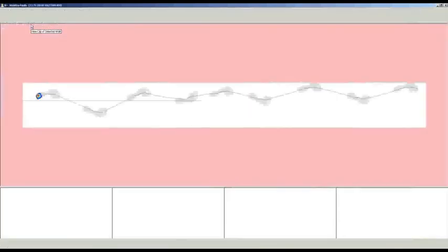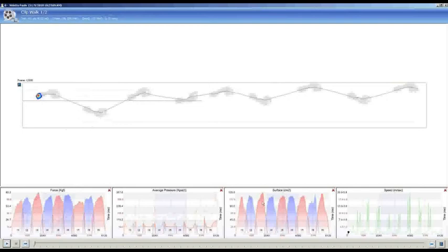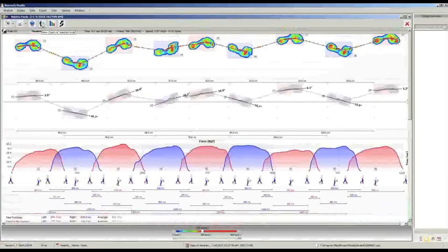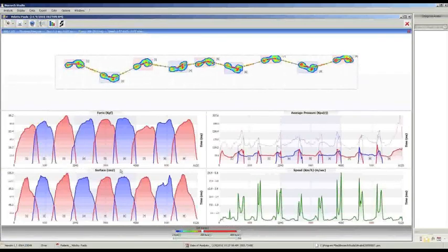Then we have the clip walk — it's like a movie. If you click on play, you can see how the pressure moves over all the foot steps, showing the distribution of pressure during time. These graphs are animated so we can see the comparison between the distribution of pressure and, for example, the overload and discharge of force, the surface of contact, or the speed of the foot. We can also see the charts of selected walk showing the force, average pressure, surface, speed, and the distribution of pressure with footprints — not animated, just a screenshot of the entire acquisition.